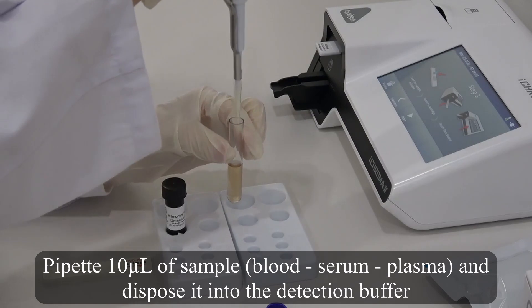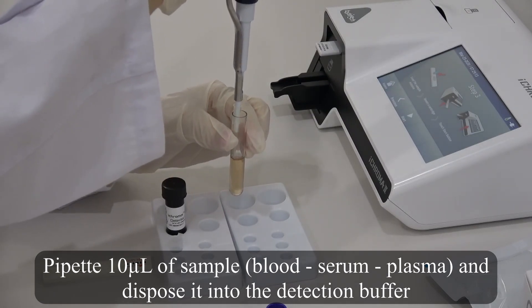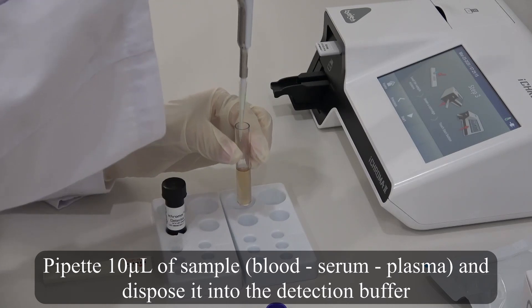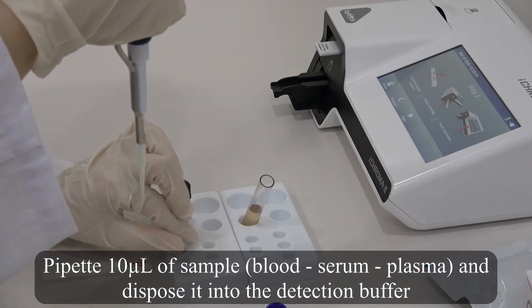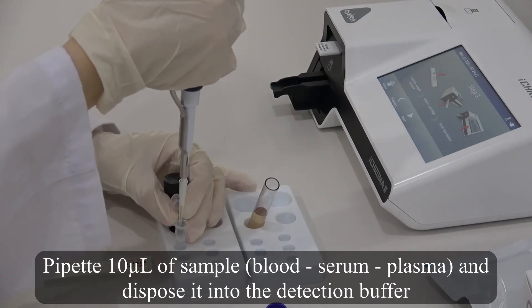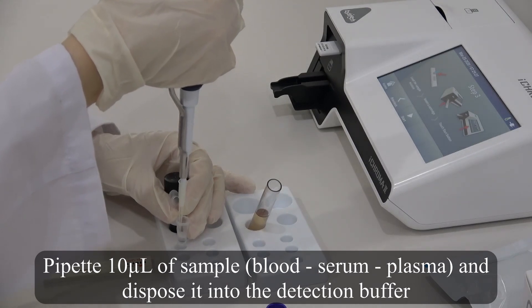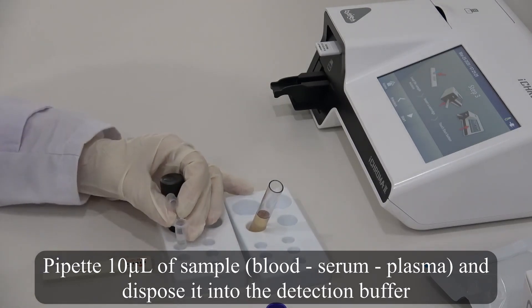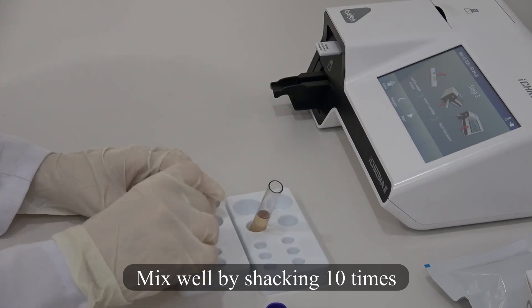Pipette 10 microliters of sample and dispose it into the detection buffer. Mix well by shaking 10 times.